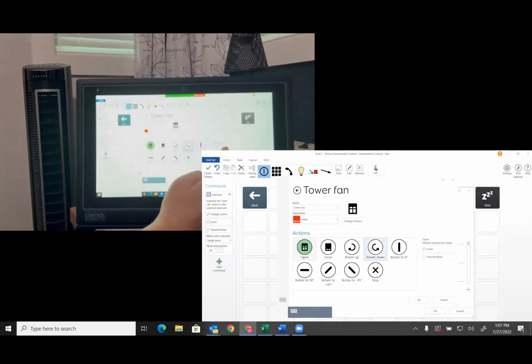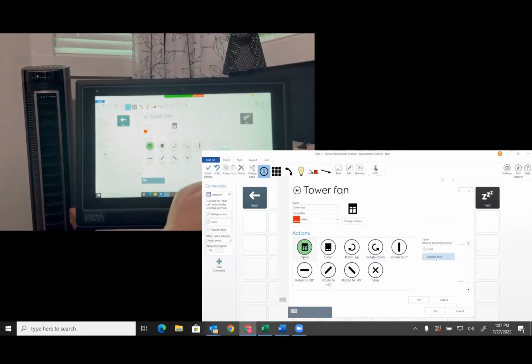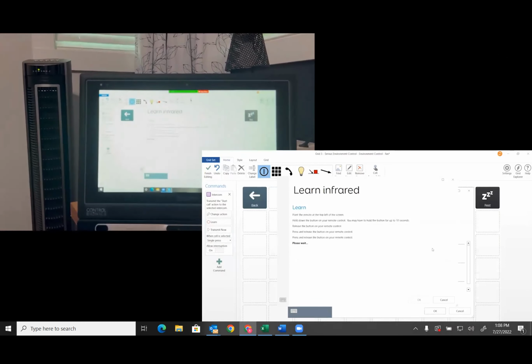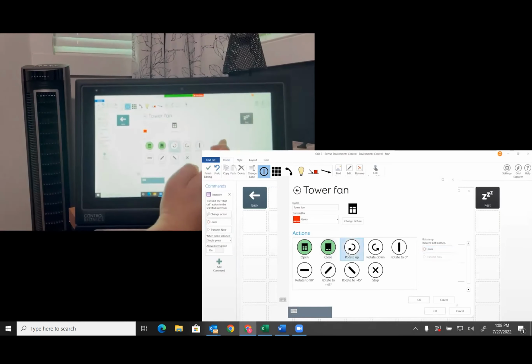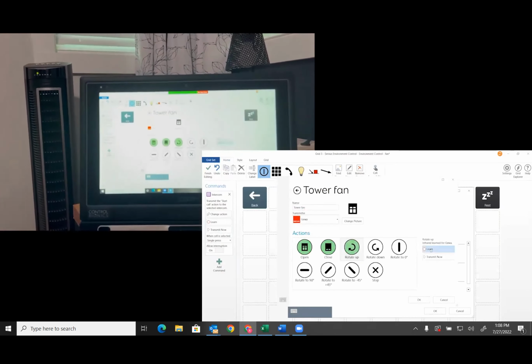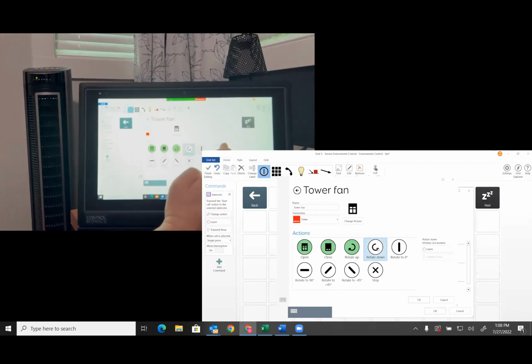Here is where I encourage you to click the Transmit Now button to send a test signal to your device to make sure the signal programmed successfully, because mine did not. What I discovered in this process is that because my remote has buttons that have different signal outputs each time you hit the same button, it was learning a command that was different than what I intended.